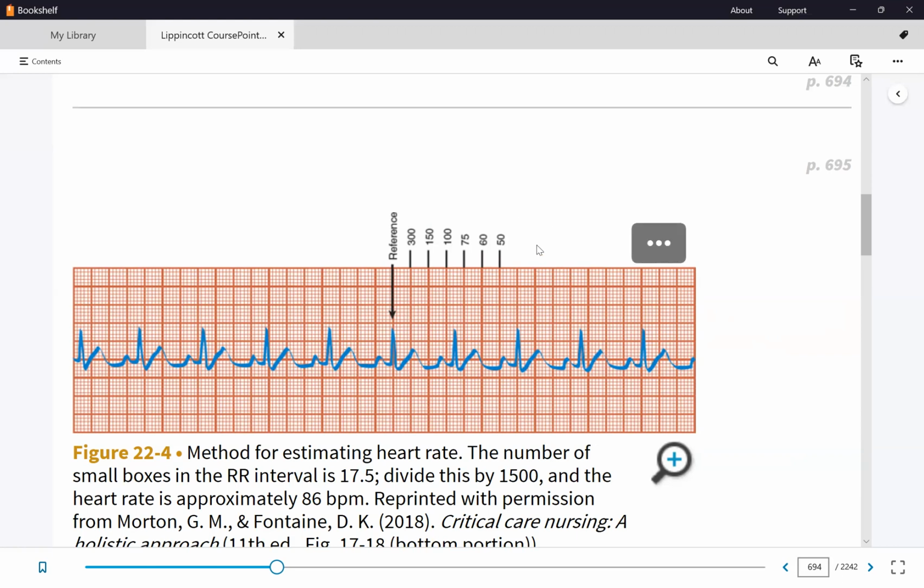So our 1 minute would be from here to here, yeah? I mean, no, not 1 minute, 6 seconds. So 6 seconds will be from here to here. You agree? Yes. Okay, so we'll measure from here to here. We'll disregard the rest of it.